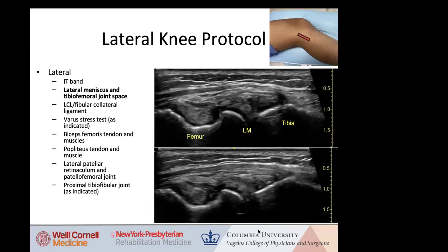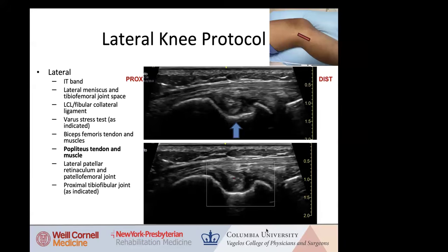It's a curved tendon that changes directions abruptly and doesn't follow a normal course that we expect a tendon to follow. And so really having that multi-positional imaging, where you might not get the whole tendon in any one view, you might have to have several views at slightly different angles in order to bring that tendon in appropriately and eliminate any anisotropy, is really important.